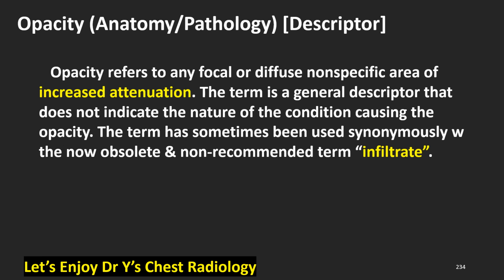Opacity, anatomy, pathology, descriptor. Opacity refers to any focal or diffuse nonspecific area of increased attenuation. The term is a general descriptor that does not indicate the nature of the condition causing the opacity. The term has sometimes been used synonymously with the now obsolete and non-recommended term infiltrate.